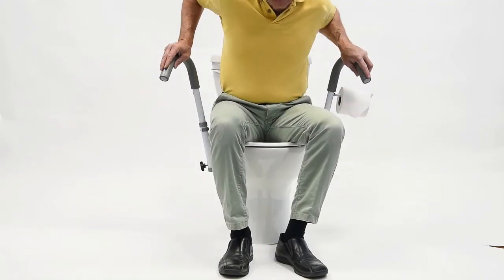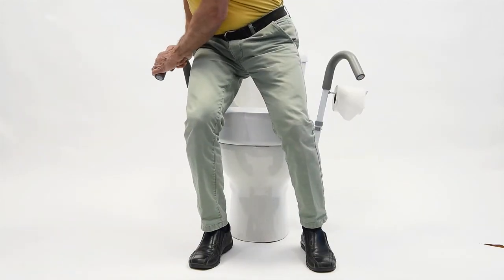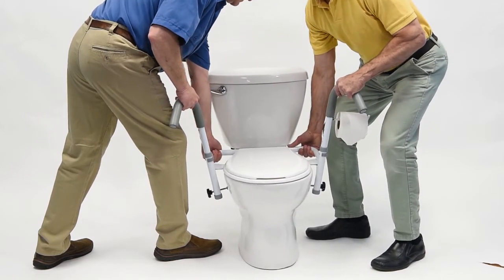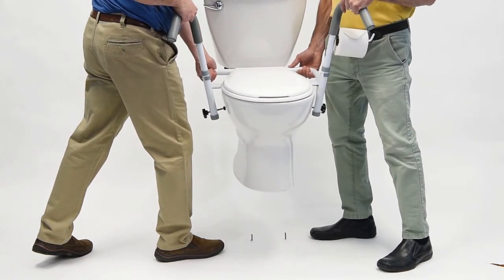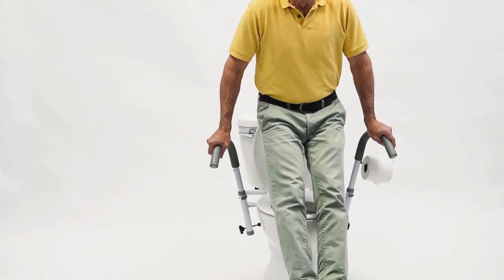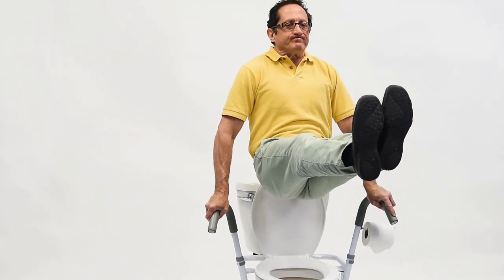The Ultra Frame is incredibly strong and sturdy. It can be used with two hands or one, and is strong enough to fully support itself and the weight of the toilet, seen here for demonstration, and is strong enough for the user to place 100% of their weight on both arms without any flexing.